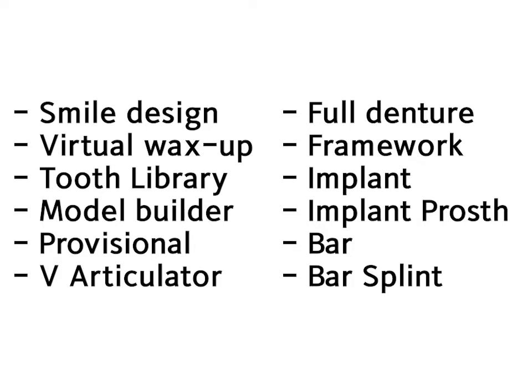The next one is the virtual wax-up. This module allows dental care providers, especially technicians, to create virtual wax-ups of cases in a very efficient manner that replaces the traditional hot wax laboratory procedures. And our classes are focused on this point actually. From these virtual wax-ups, physical mock-ups can be 3D printed for assessment in the patient's mouth. Besides their use for restorative mock-ups, this type of module is also used to design splints for surgical procedures such as crown lengthening.